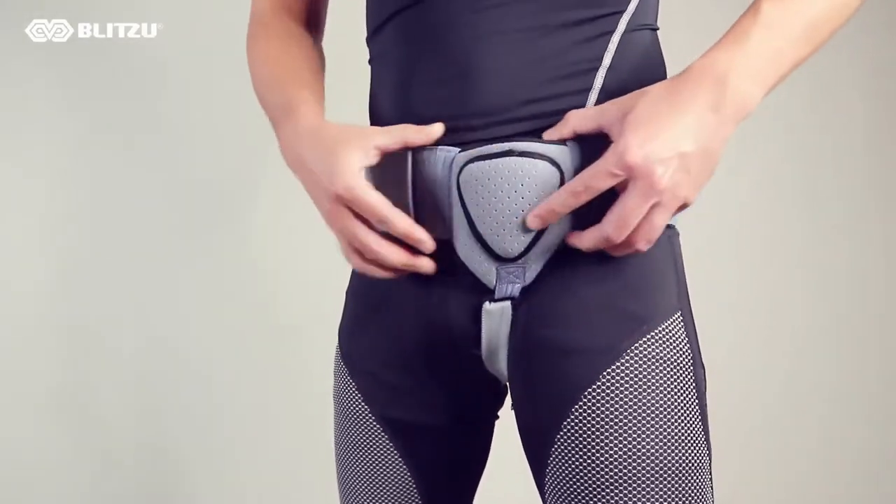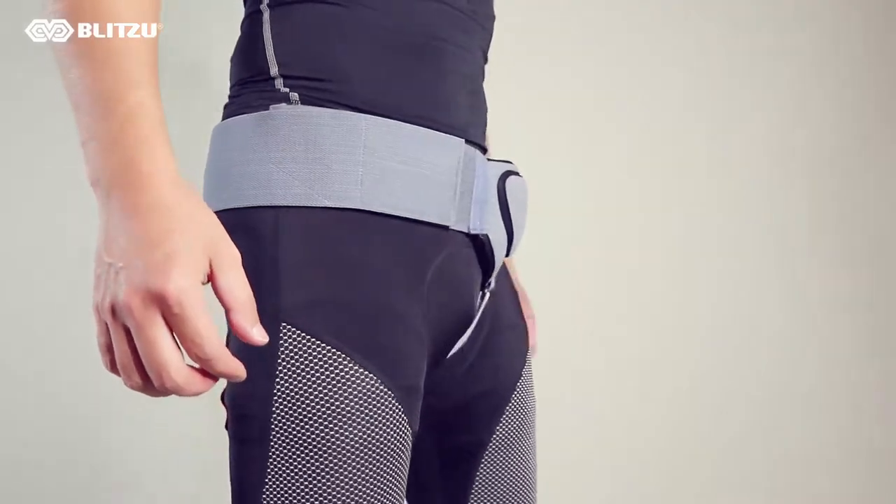Our hernia belt fits under your clothes inconspicuously and is comfortable to wear all day.